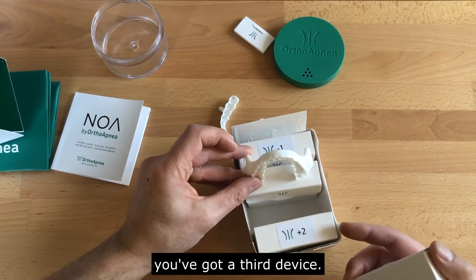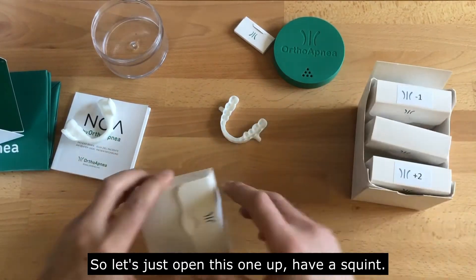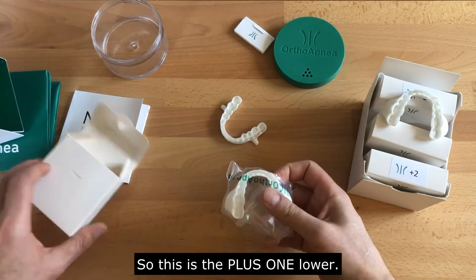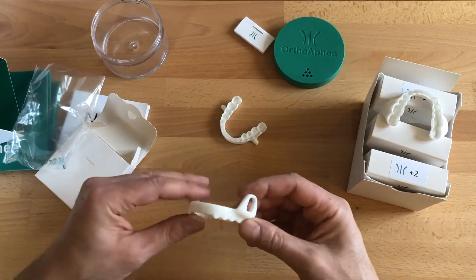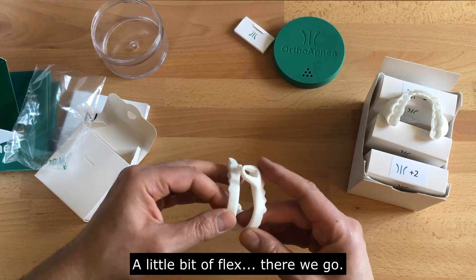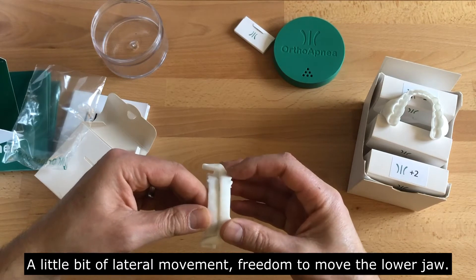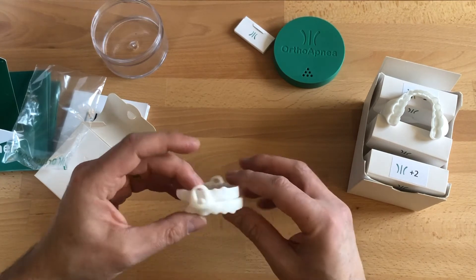If it's not enough protrusion, you can swap out the lower for one that's a bit more advanced. And again, you've got a third device — a little bit more protrusion. This is the plus-one lower, and it even has a 'plus one' marking on it. With a little flex, it couldn't really be much easier. A little bit more protrusion, and the same thing — a little bit of lateral movement, freedom to move the lower jaw. Doesn't impede the oral airway.